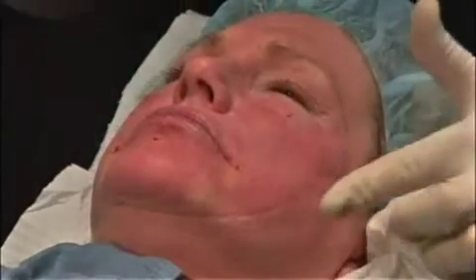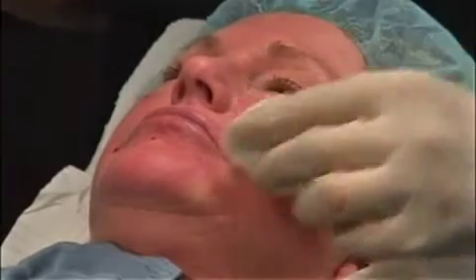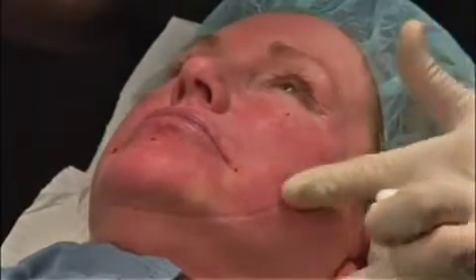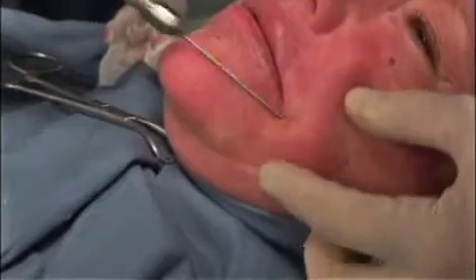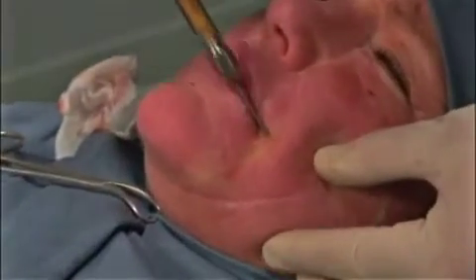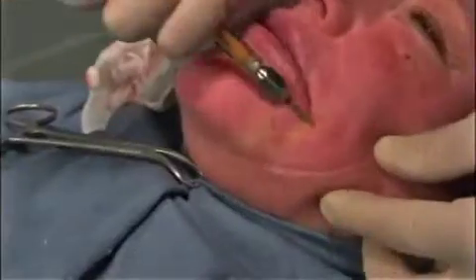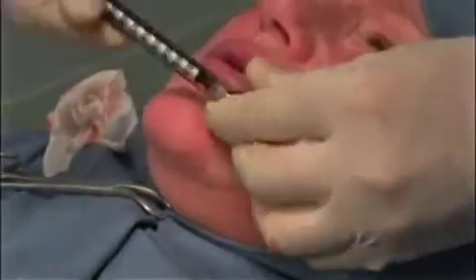I prefer to inject one side of the face and then the same anatomical area on the opposite side of the face and look for symmetry. Often, patients' faces are asymmetric and more fat is placed on one side of the face than the other.